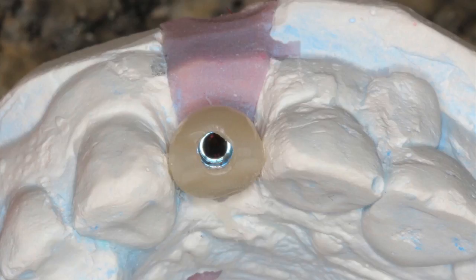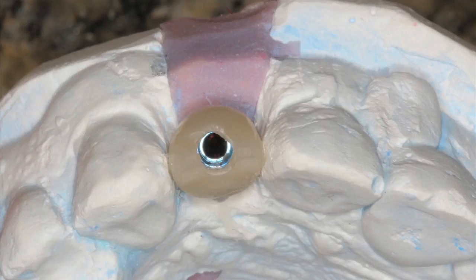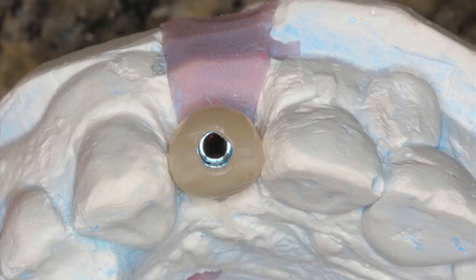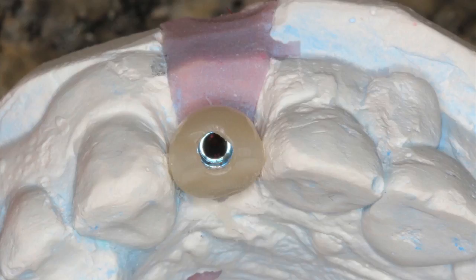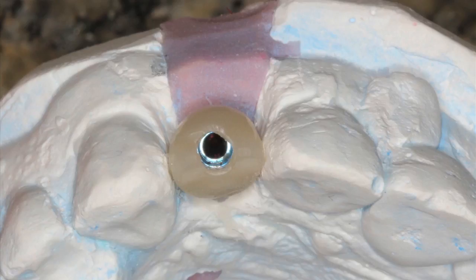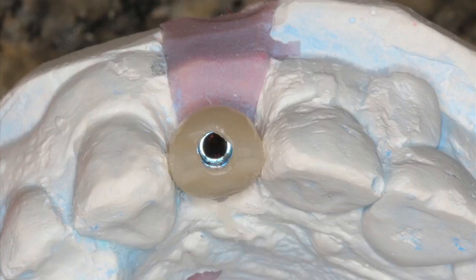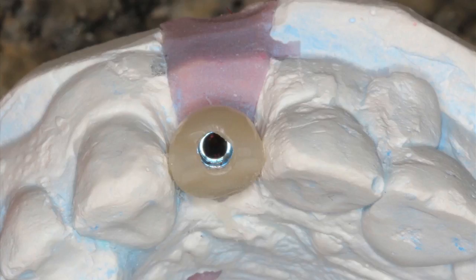Now we're ready to go to surgery — atraumatically take out our tooth, place our implant at a pre-determined, pre-positioned site based on the surgical guide. Based on the surgical guide, we're able to pre-make an implant temporary using the CEREC 3D technology. Thank you very much.